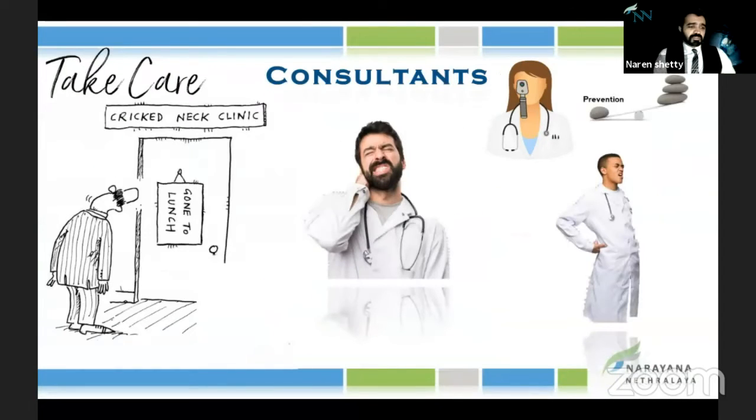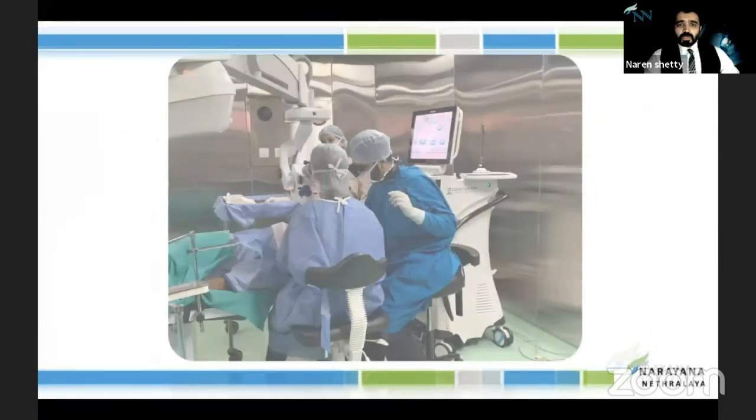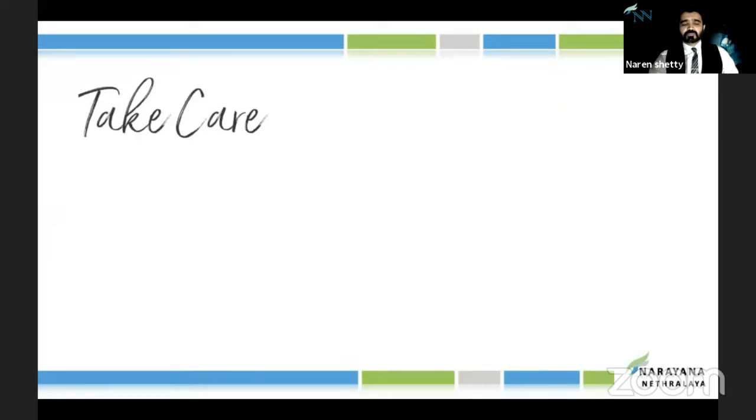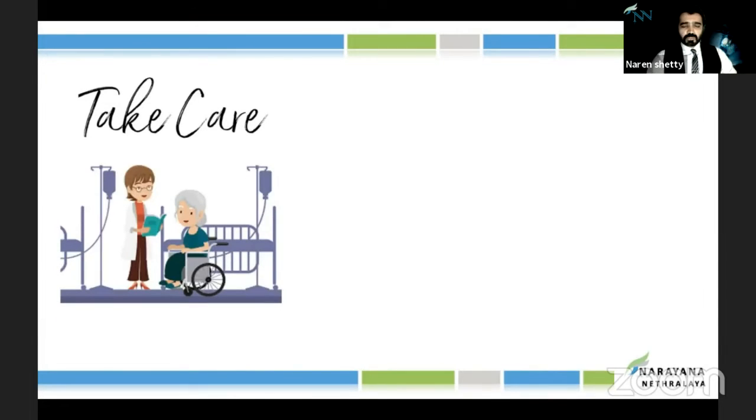As you all know, I think it's been an occupational hazard where a lot of ophthalmic surgeons have a lot of issues with their neck and back. This is because of constant operating or bending abnormally while you're seeing in the slit lamp. Especially like you see in the image, when you're doing your training, you really struggle. And with the coming of the 3D system, you can just simply relax, sit back, and operate without bending or sitting in a very awkward position.